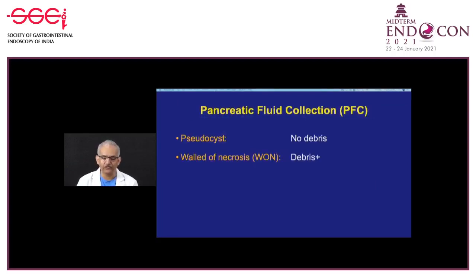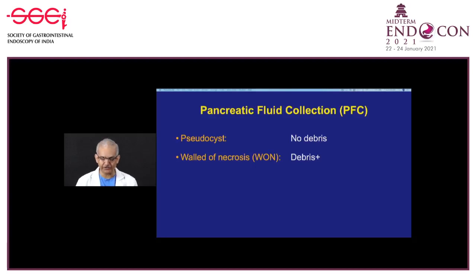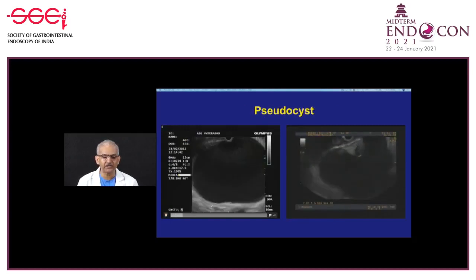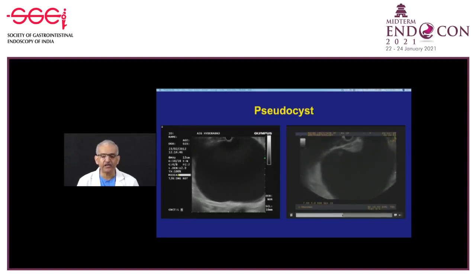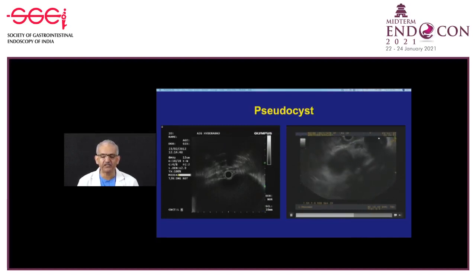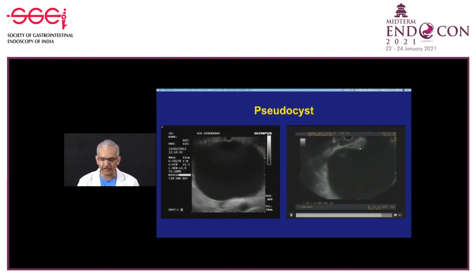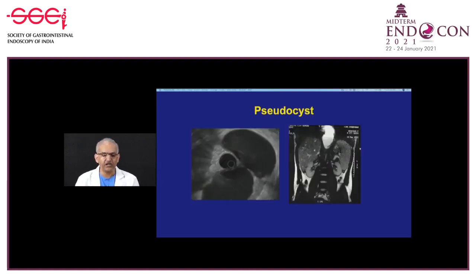Pancreatic fluid collections are broadly classified into two types when mature: pseudocyst, which does not have any debris, and walled-off necrosis, which has debris inside the fluid cavity of variable percentage. Two videos show huge collections: the one on the left panel is a pure pseudocyst with no debris, and the right panel shows a large U-shaped collection. Both are pure pseudocysts. You can also see a little bit of pancreas with upstream dilated pancreatic duct.